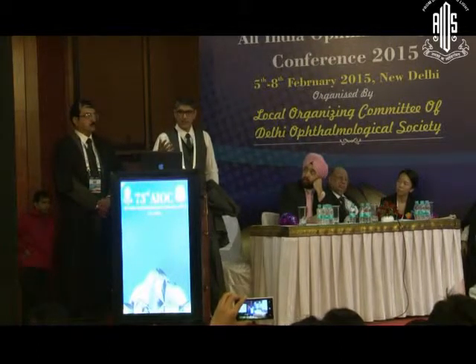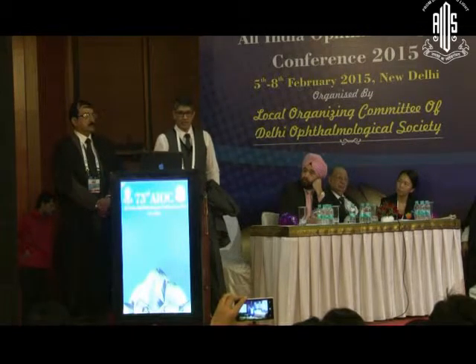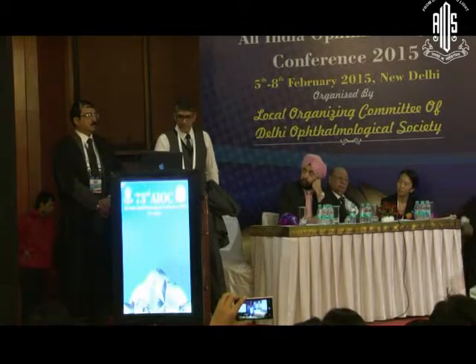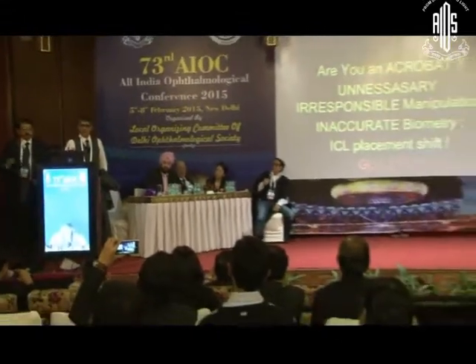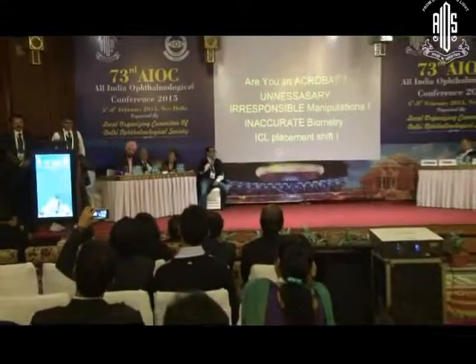But the thing is, if you remove the ICL and then remove the cataract, put an IOL, and then wait for some time, there's capsular contraction, again there is high residual hyperopia, and the patient is very uncomfortable, has to wear thick glasses. And then if you put a primary, you put two lenses, again the refraction may not be very accurate because you have to calculate it, and there is some amount of error which can come even by putting two lenses, positioning the lenses.